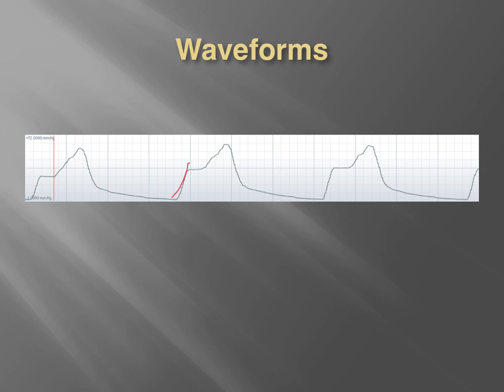And when we first had her, the waveform was very shark finny, okay? There was no doubt in our minds of what had happened with this patient. She had difficulty breathing to begin with, history of COPD, and her inhalers weren't working for her, and unfortunately they called for us too late. Now, what is probably happening here is that even though we got some normalcy here, we can see that her end tidal shoots way up.